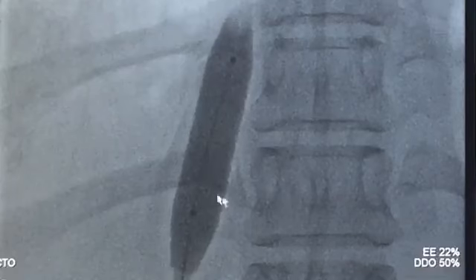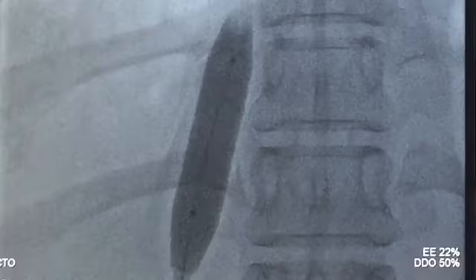So what we are trying to do now is take a large balloon so that we are very centrally placed, and try to take the blunt end of a wire and just poke lightly to see whether we can manage to go in there, but that's not happening over here.